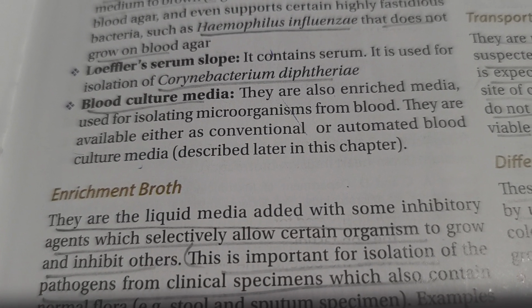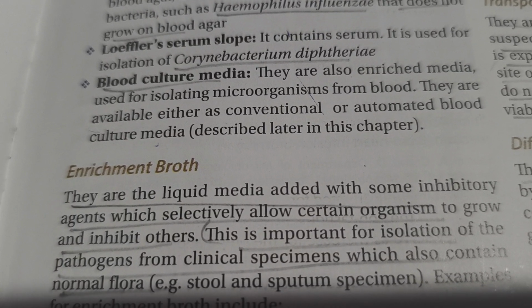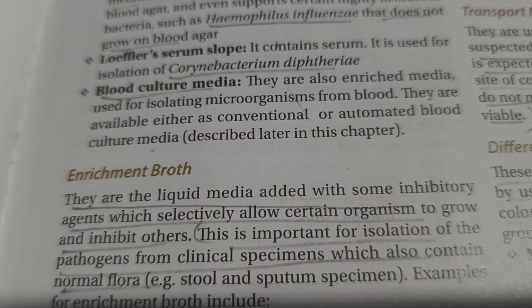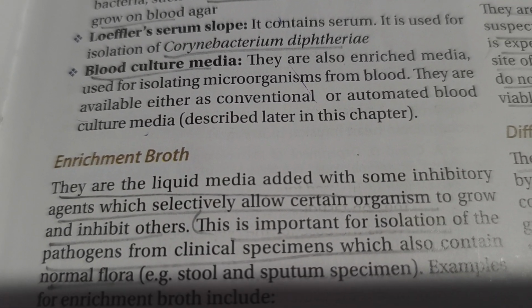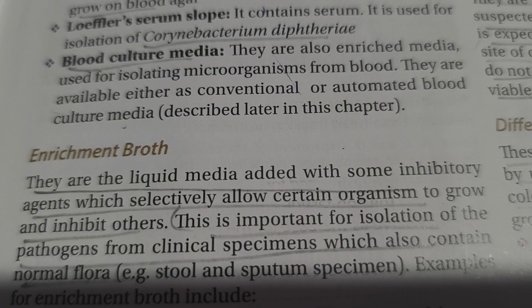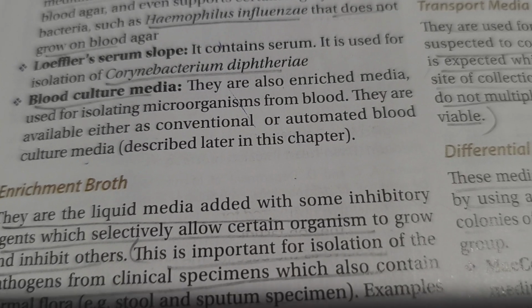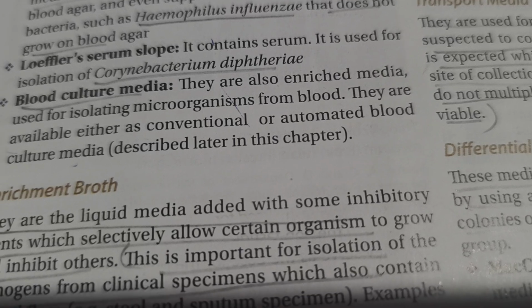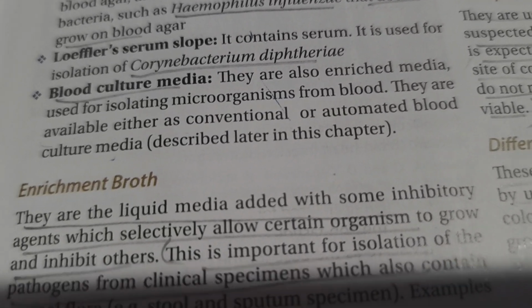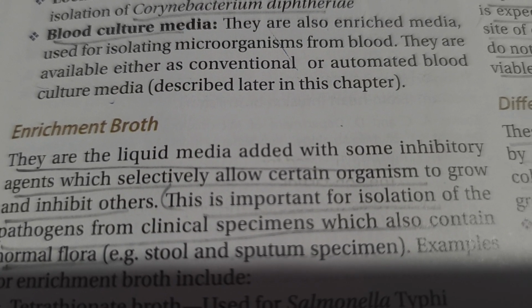Loeffler's serum slope. It contains serum. It is used for isolation of Corynebacterium diphtheriae. Blood culture media. They are also enriched media used for isolating microorganisms from the blood. They are available either as conventional or automated blood culture media.